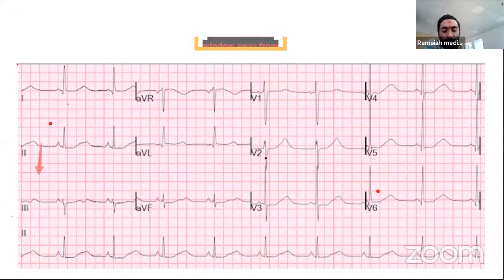Then we look at the T wave and some intervals. We have the QT interval, which is 8 to 10 small squares, and the T wave, which has a slow rise and a slow fall. The QT interval is usually half of the RR interval, and there is a correction for QT. If the QT is prolonged, it can lead to torsade.